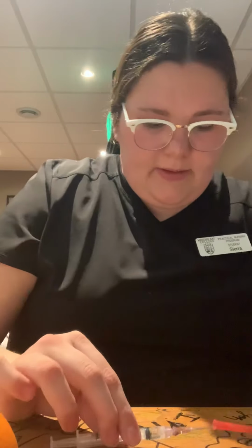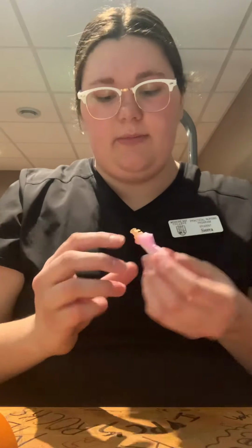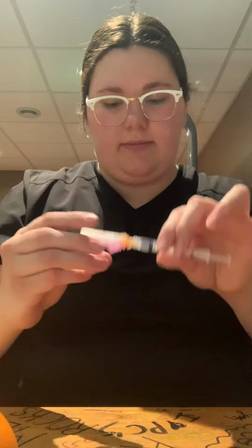Now we're gonna one-handed scoop our lid back on. Remove our filter needle and dispose of this into the sharps. Now we need our needle. So we're going to stick this on and get this ready and prepared to use.